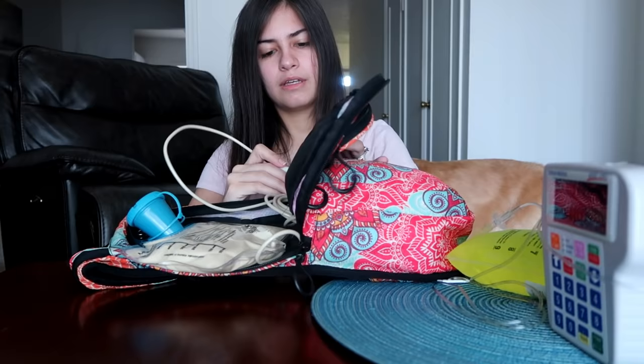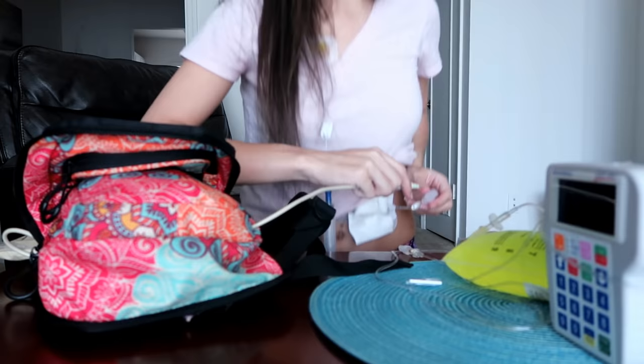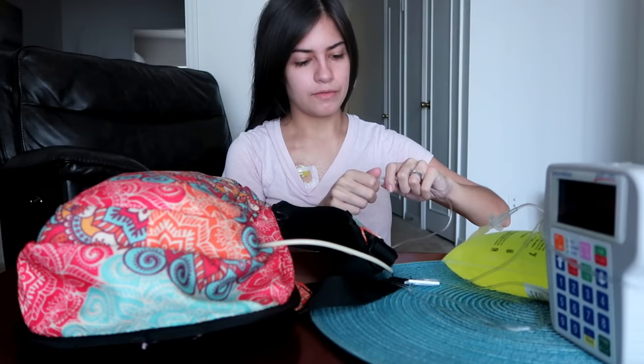Then I feed this through the little hole in the side my seamstress put there. And then this connects to my J-tube, and I hit run on the pump and I'm good to go. But first I wanna finish connecting to my infusion.